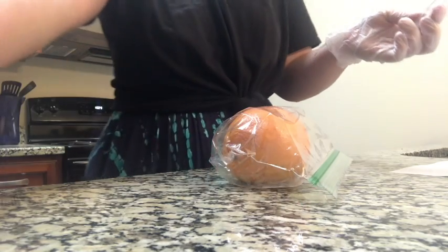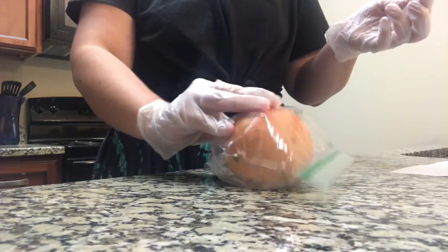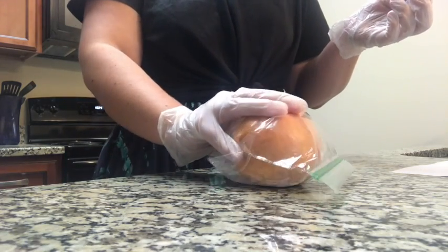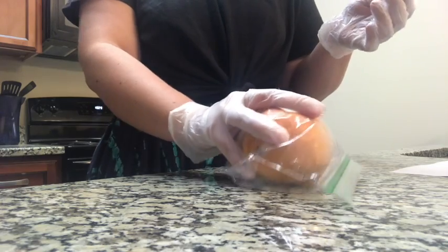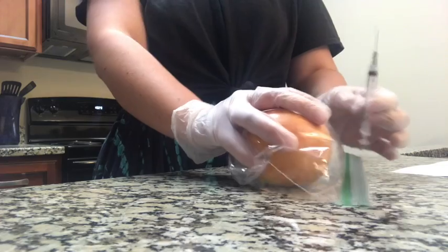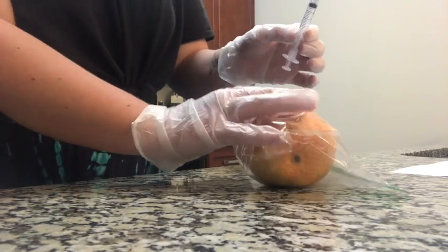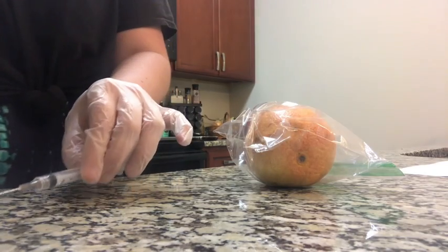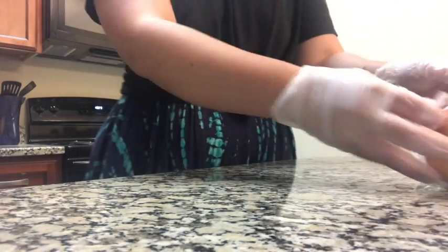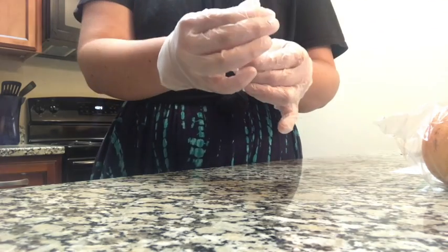Take some gauze. Put on the area, and I will massage it. This would go in the sharps container. I would not recap, but for purposes of this video, I'm going to. But I would use the one-handed scoop method, making sure that I don't get myself.